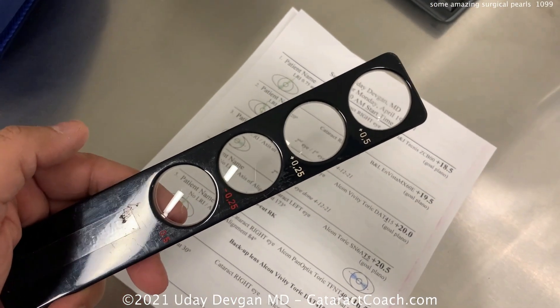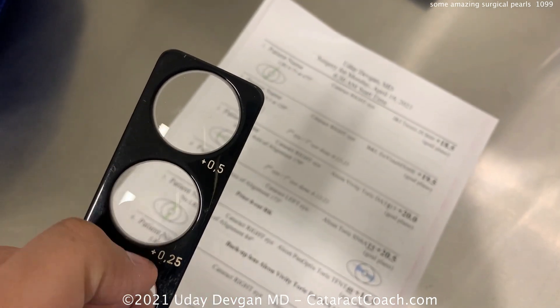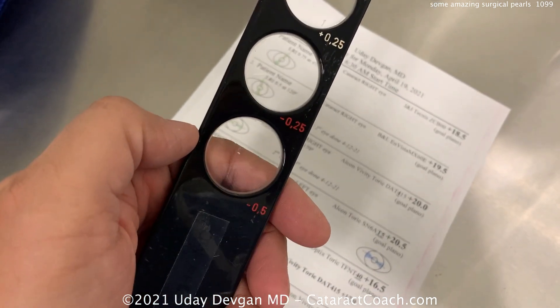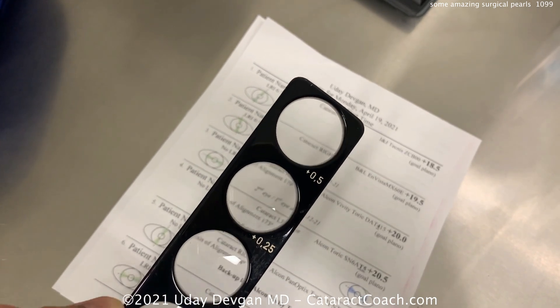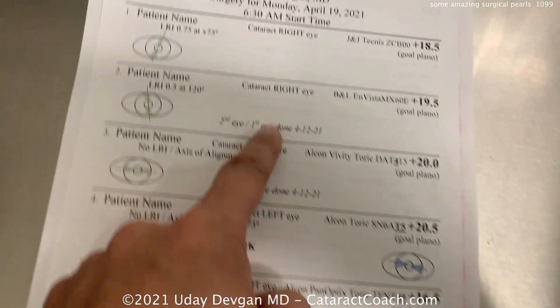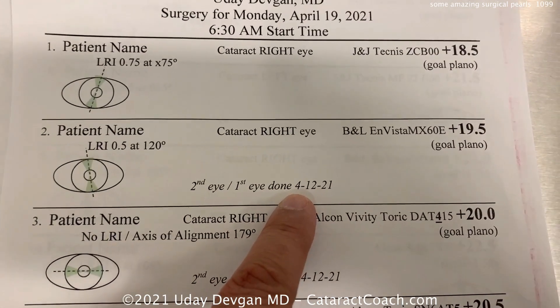These are two things you should be doing in your operating room: number one is that sheet, and number two is this lens stick. This device is a simple stick with four lenses: plus a half diopter, plus a quarter, minus a quarter, and minus a half. We use this to get a quick idea of the patient's refractive outcome from the first eye.